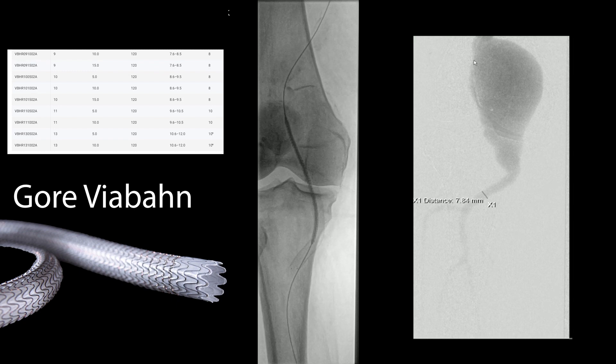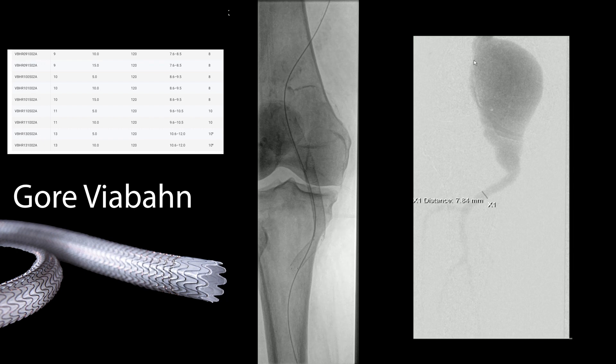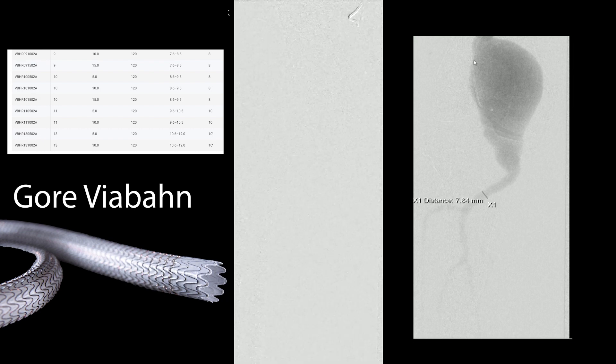Once we've got that deployed, we'll work up to the proximal area. In terms of deployment, the way this works is there's just a string in the handle — once you get into position you pull the string and it expands on its own. You can do this nice and sequentially, slowly — there's nothing rushed about it. You deploy it, then remove the delivery system, check how much length you need to achieve a seal, and based on that you choose another Viabahn. You build these up as needed — oversized distally, oversized proximally — choosing the length as you step up.